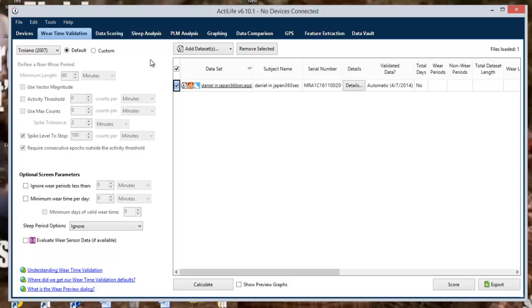Once your algorithm is selected, you can then calculate the data set by selecting calculate in the bottom center of the screen.